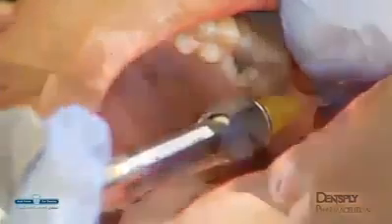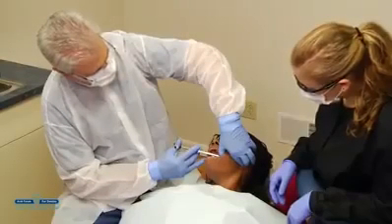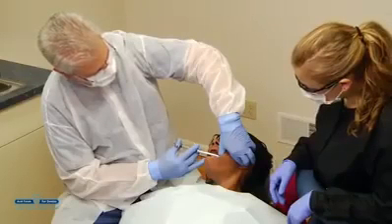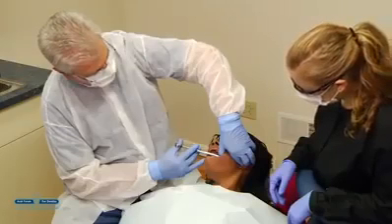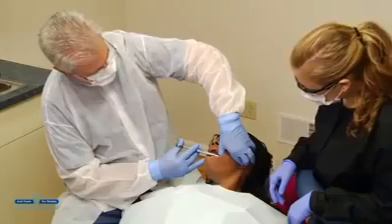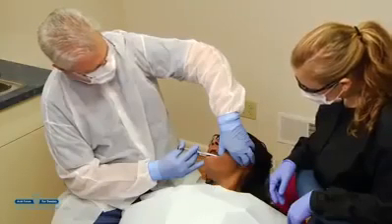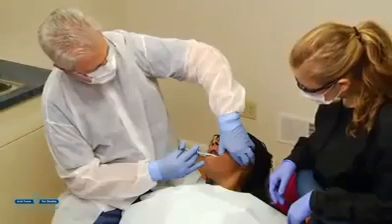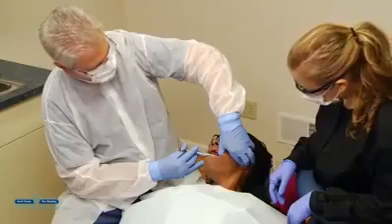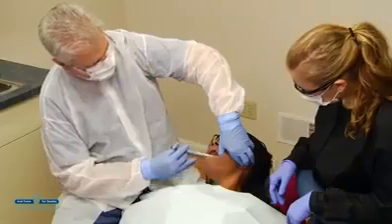is contacted. When the needle impinges on the condylar neck, it is felt as a solid stop, in contrast to a glancing contact. Once the target is reached, the needle is backed off the condylar neck 1 or 2 millimeters, aspiration is performed, and the entire content of the cartridge is injected over a 1-minute period. The patient is then cautioned to keep the mouth open for 30 seconds after the needle is withdrawn. This maneuver is thought to help spread the anesthetic solution and minimize the distance from the injection site to the nerves of interest. Typically, anesthesia occurs within 5 minutes after injection.